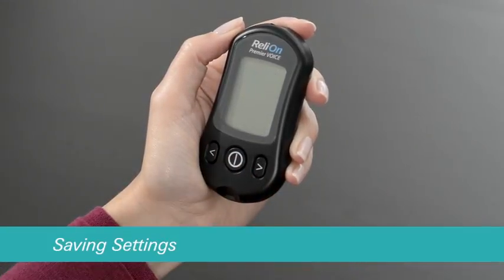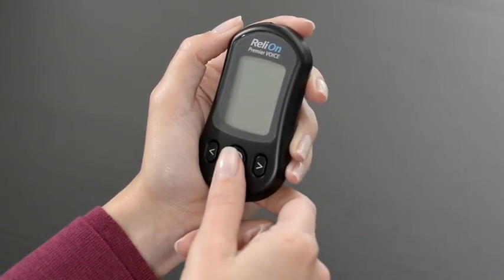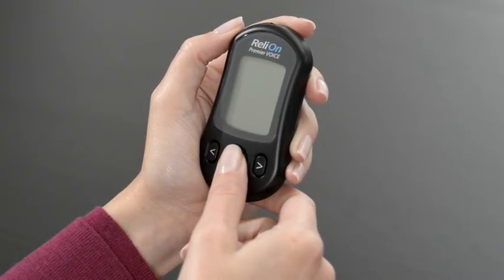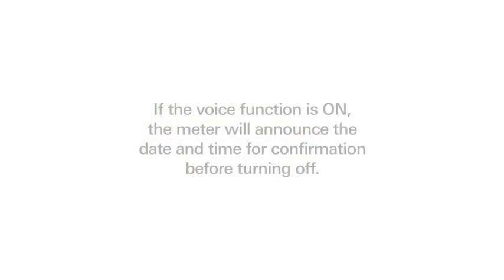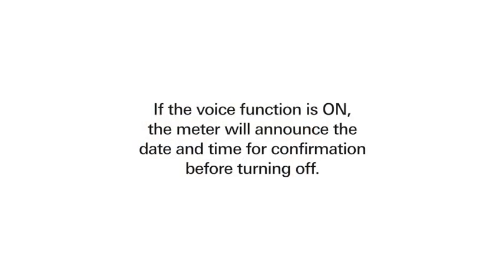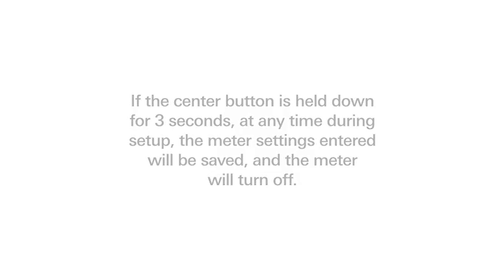Meter setup is now complete. Press and hold the center button for three seconds and the meter will save all of the settings and turn off. If the voice function is on, the meter will announce the date and time for confirmation before turning off. If the center button is held down for three seconds at any time during setup, the meter settings entered will be saved and the meter will turn off.